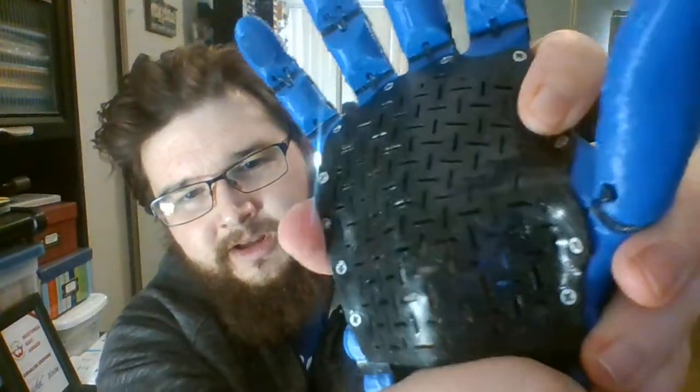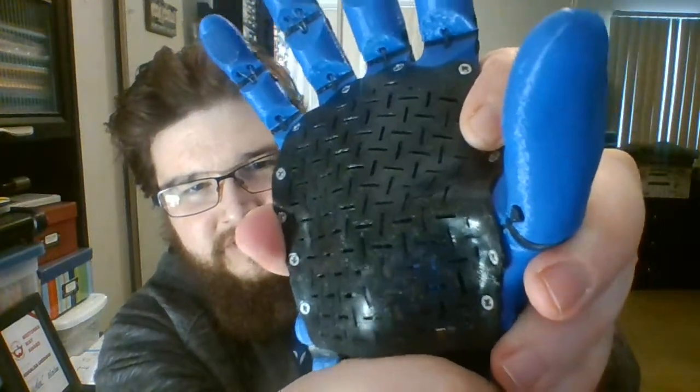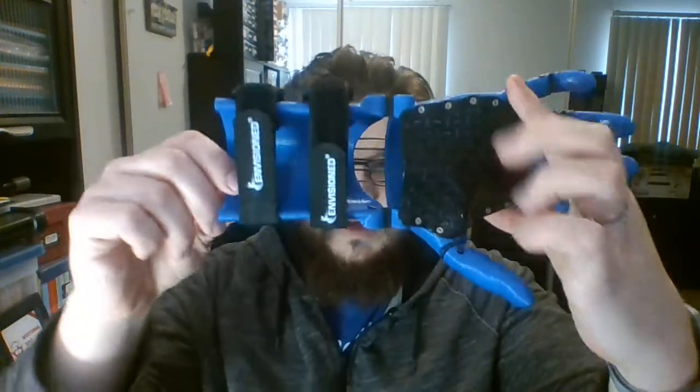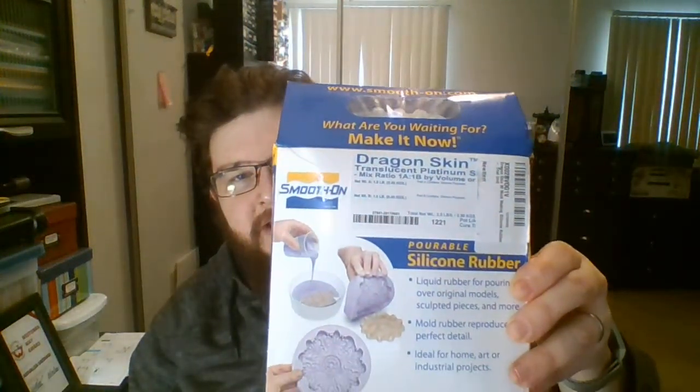For construction: the PLA components are eSUN PLA+, so stronger than regular PLA. The TPU components are NinjaTek Cheetah, which isn't quite as soft as the recommended NinjaFlex — it's a little easier to print, but it still has considerable stretch to it. The tendons are 80-pound braided fishing line, and I've got my velcro straps. The finger grips are silicone, molded from Smooth-On Dragon Skin 30A hardness skin-safe molding silicone.